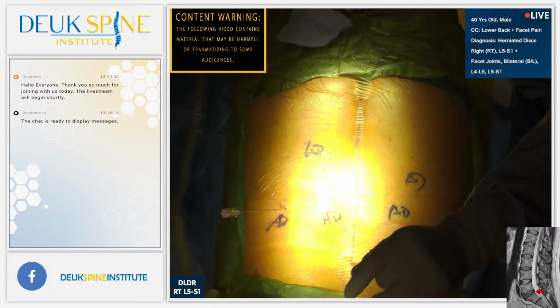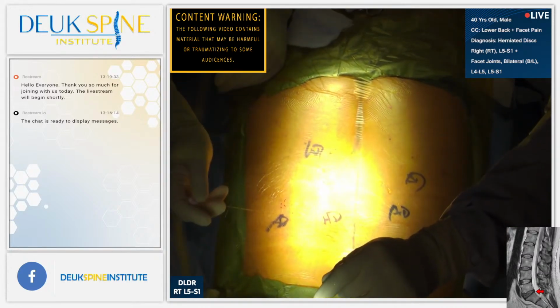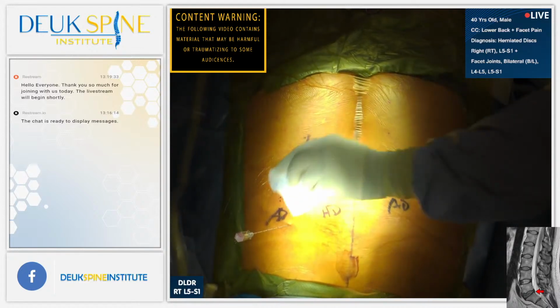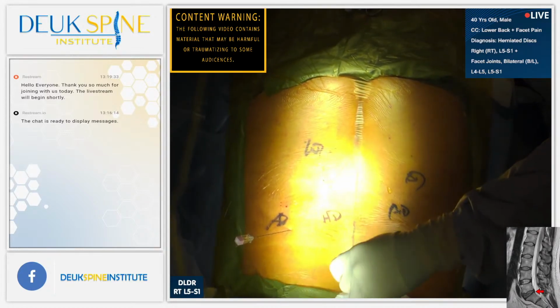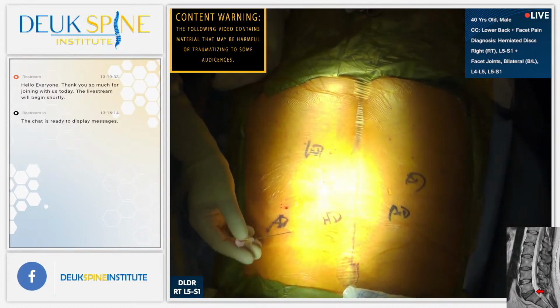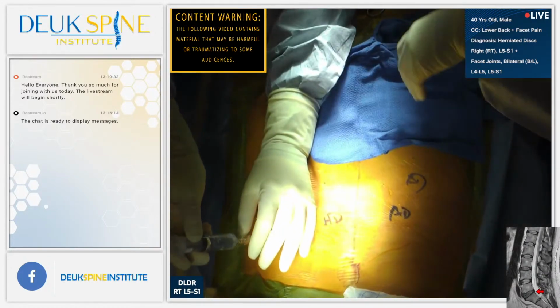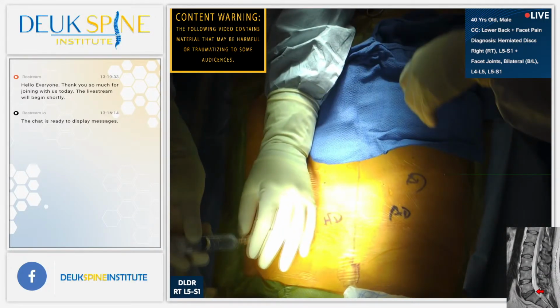Shot, I think a little too far south. All right, we've just got a lot of exposure here. How's he doing? Sounds like he's sleeping nicely. Everything okay? Yeah, I'm just trying to reconnect this mask. You want me to hold up? No, that's fine.